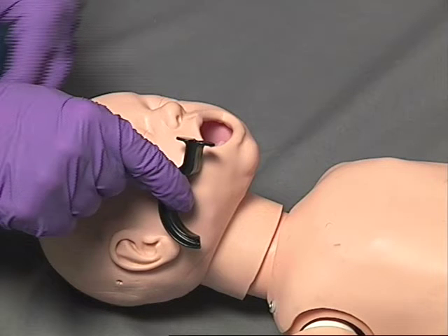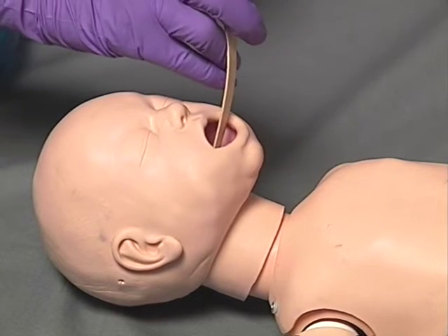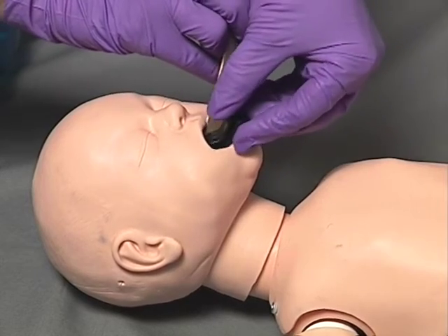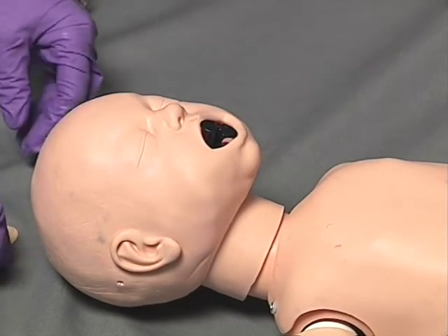Once the correct size adjunct is determined, utilize a tongue depressor or other similar device to move the patient's tongue forward and down.